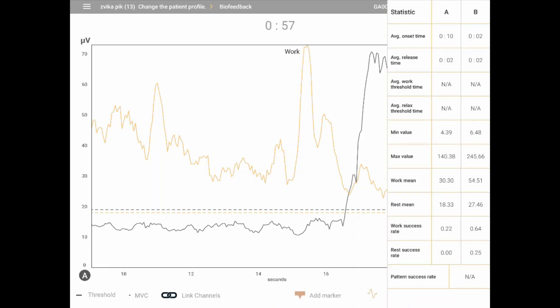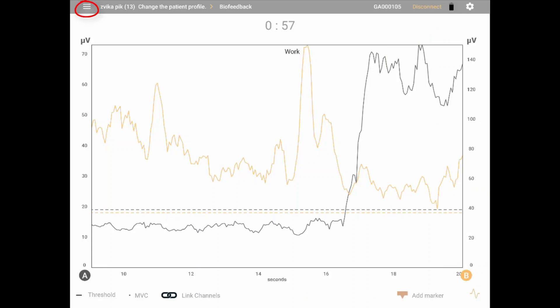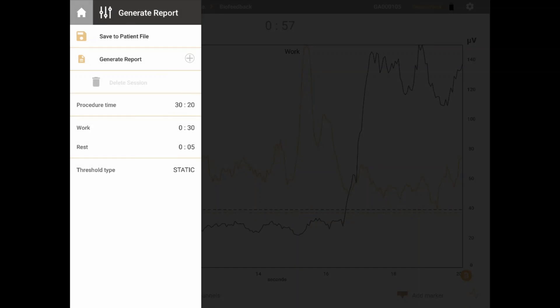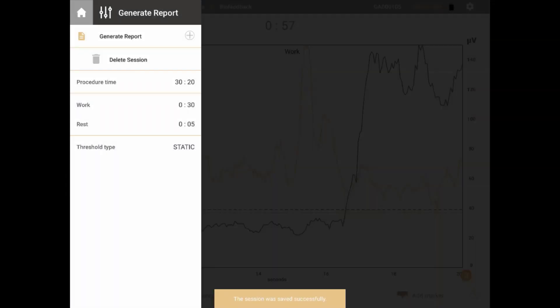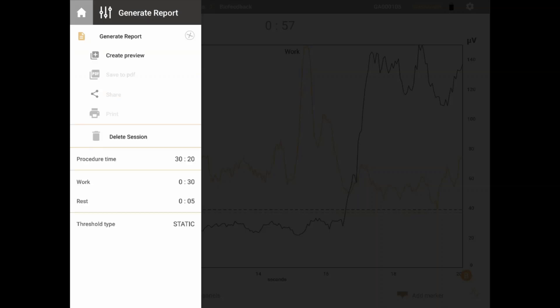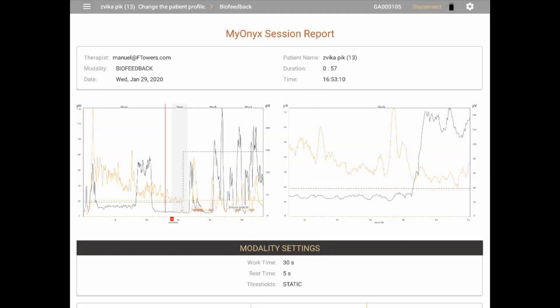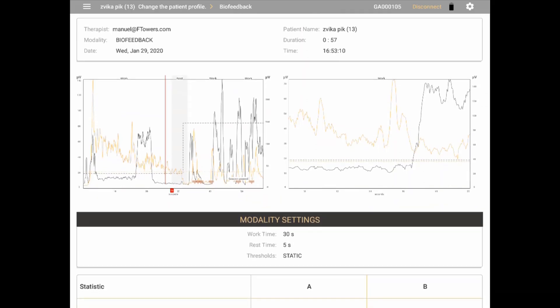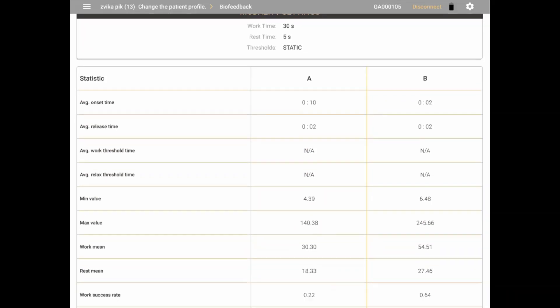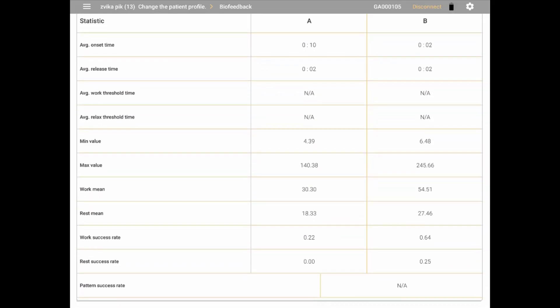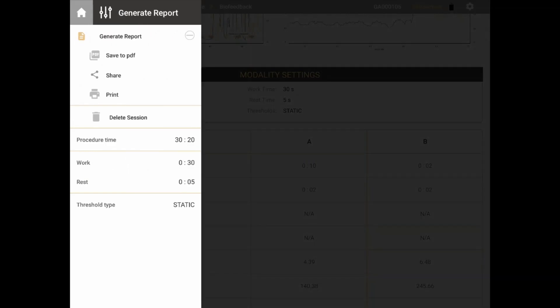To save the session, click the menu button on the top left of the screen and select Save to Patient File. If a patient is selected, the session will be saved to their file; if no patient is selected, you will be asked to select one first. From here, you may also generate a report to share with the patient or referring body — click Generate Report and then Generate Preview. The report will be displayed and includes the entire line graph view of the session, the current zoomed view of the graph, the patient's name, the date and time of the session, and all session settings and statistics. Once generated, you can save it as a PDF file locally, print it, or share it using any application installed on the tablet.